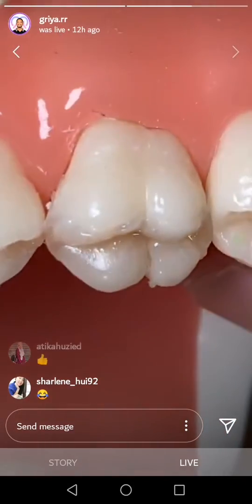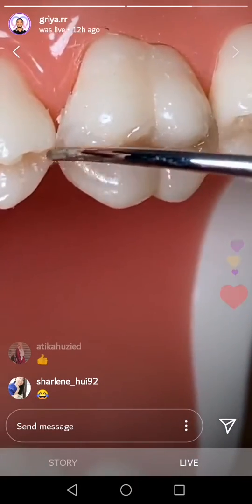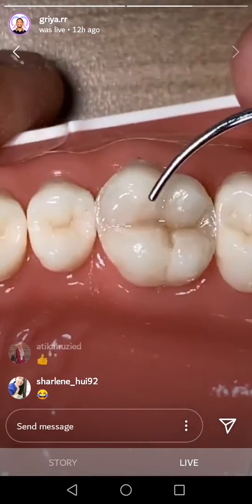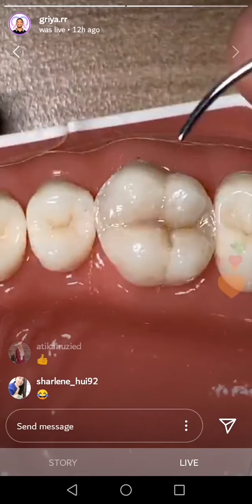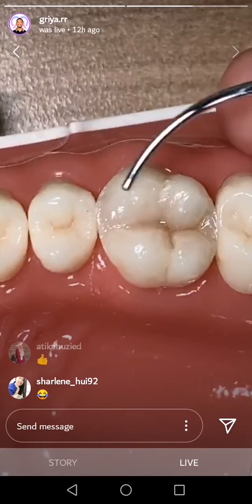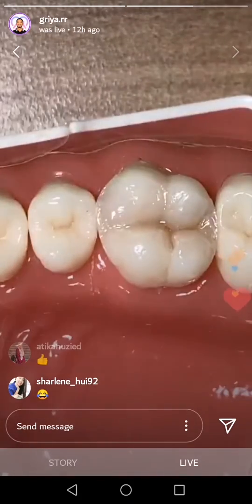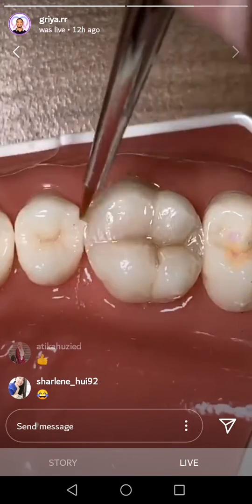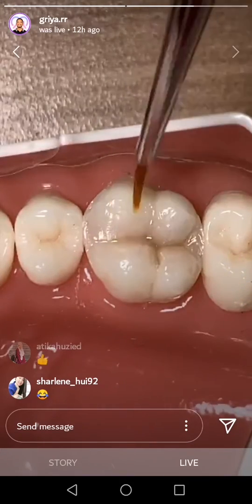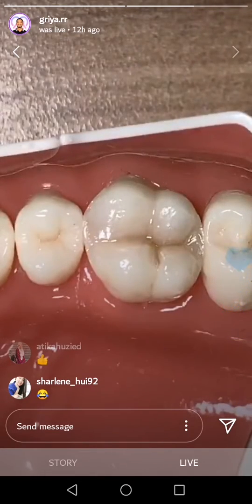Okay, and you can see from here. I have an excess, so you need to remove the excess. Yeah, always remove the excess. Okay, always remove this area, otherwise your composite will be overhanging.